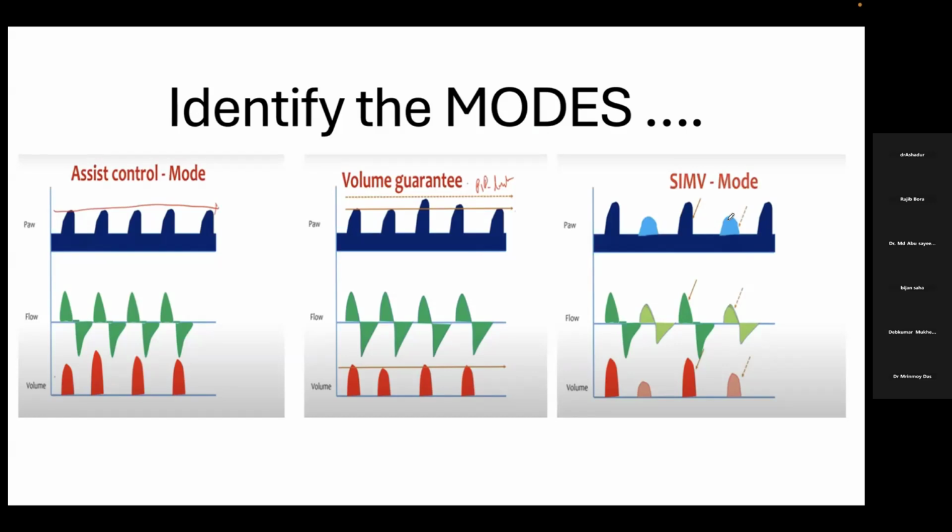Because we know that when we give pressure support in SIMV mode, our idea is that this should be 2/3 of this height. So if the patient breath is only this much, this is not adequate, so we need to go up on our pressure support. So by setting, suppose, PS of 8 or 10, if we look at these pressure loops and see that the spontaneous breaths have very little height, then probably we need to go up on our pressure supports.